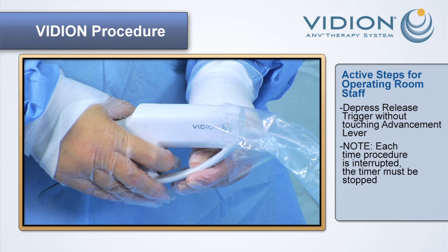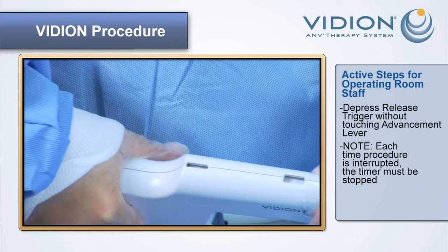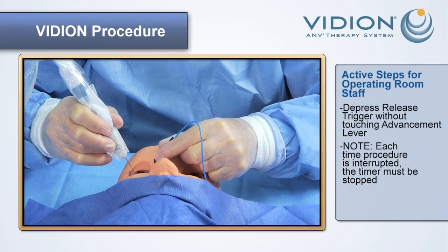Note, each time the procedure is interrupted, the timer must be stopped. When the cannula is repositioned properly again and the radiation source is advanced, the timer can be restarted for the remainder of the duration of the treatment time as specified.